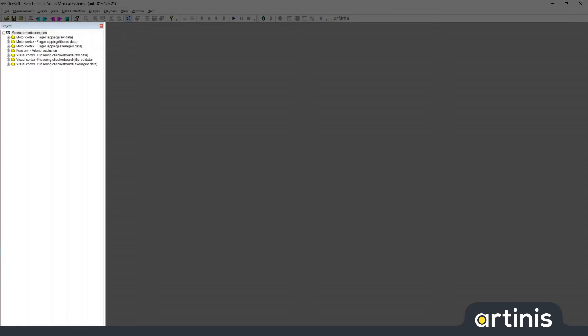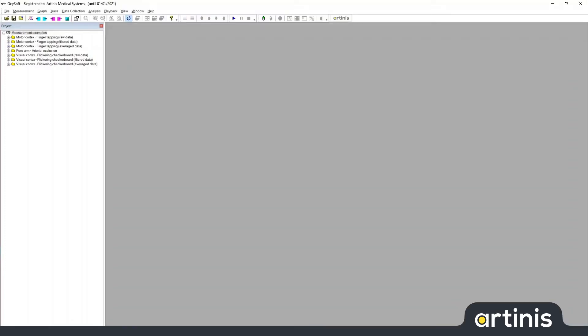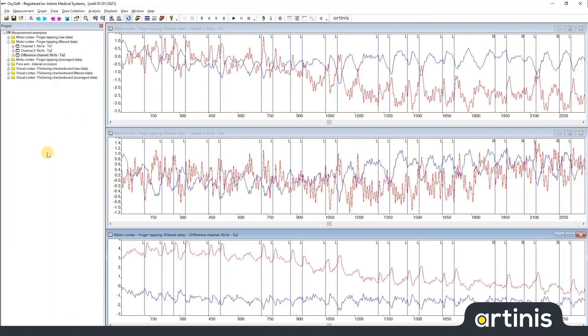Each measurement in turn contains graphs. To display the graphs of a measurement in the workspace, select the measurement and click open all graphs in the toolbar. This brings up all the graphs of that measurement.